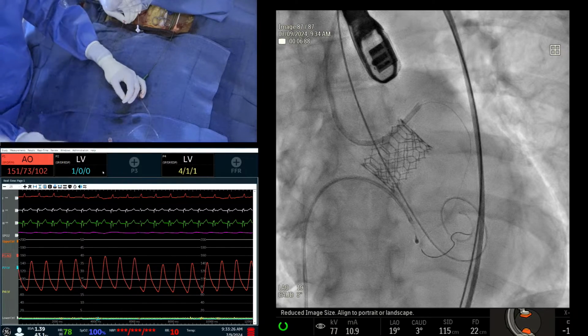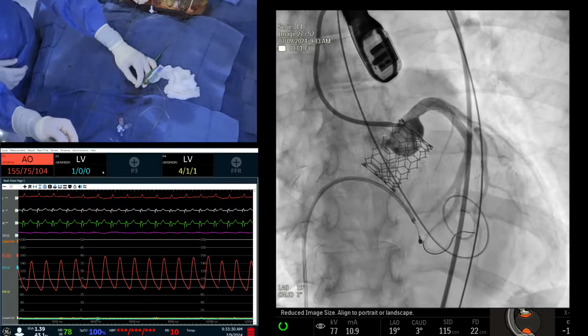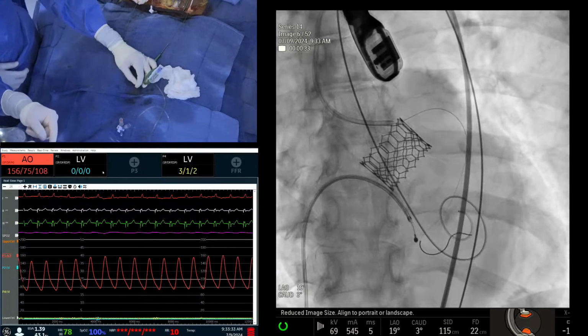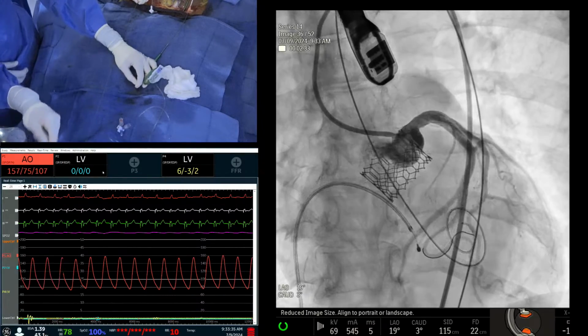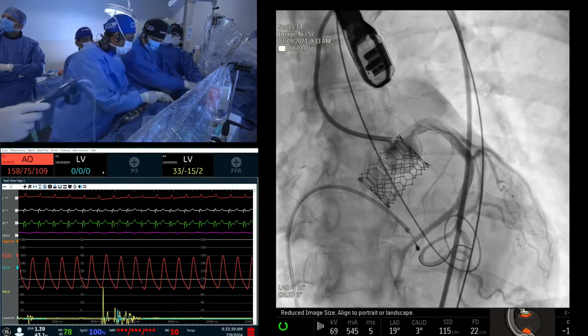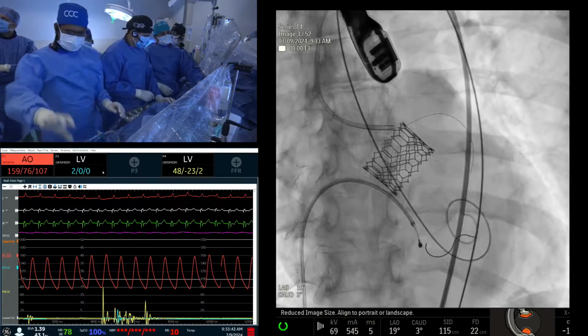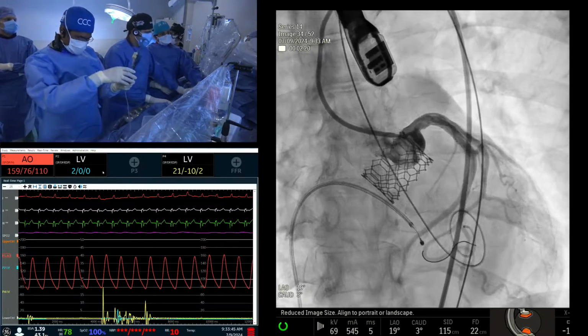But you see there, despite the 24 balloon expansion, there's a little bit of recoil when you deflate the balloon. Keep it straight, please. Yeah, let's analyze this. What are you seeing here? The line is still there of the leaflet, but the leaflet is below the lower surface of the left main. So this is just a contingency in case the valve rides up, right?